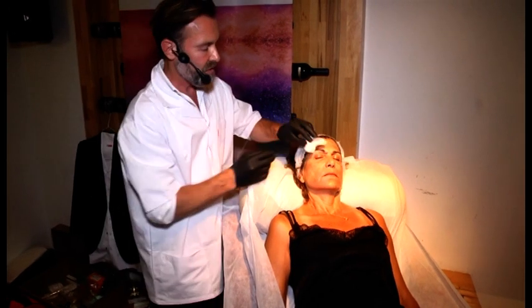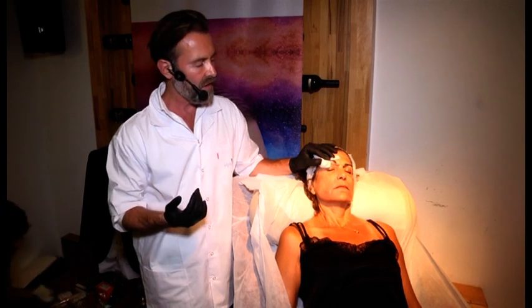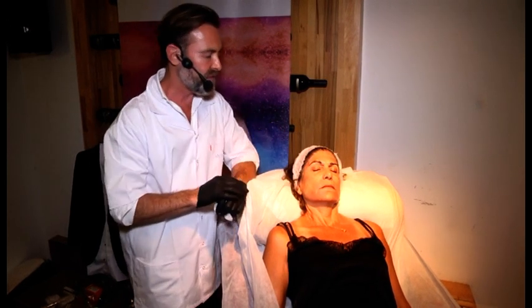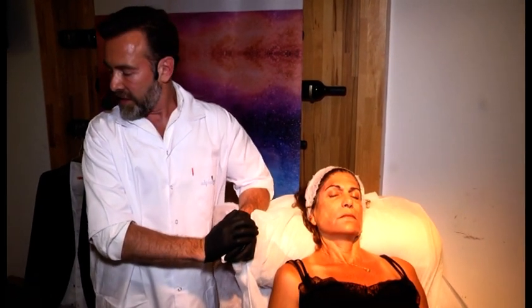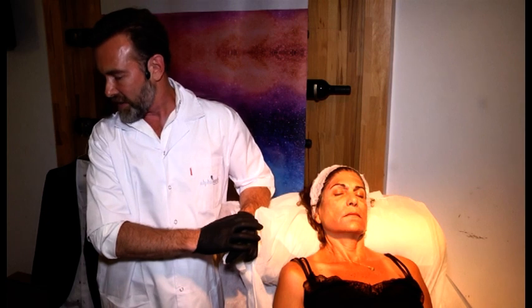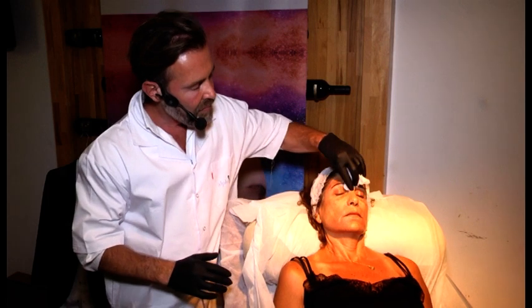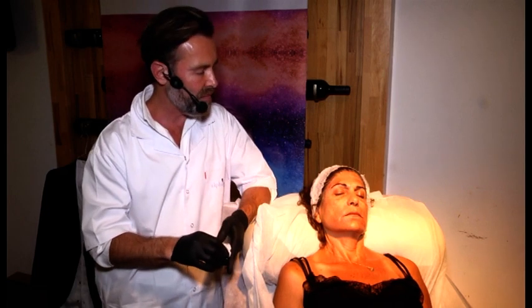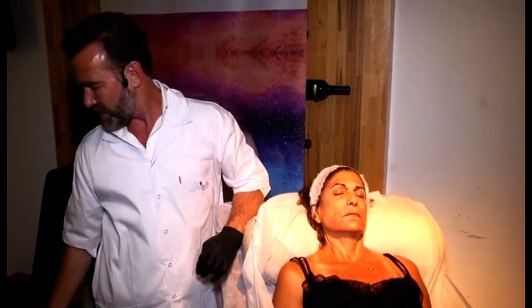And the product of choice in the frontal concavity for me is Belotero Intense. Of course, you can give amazing results with Belotero Balance as well. It's very easy to even out the product with Balance. But yeah, I will use a cannula. I will use a 22 gauge cannula, please. But with Belotero Intense, you need much less product to get the same result. That's why I use Intense, because you need less product to achieve the same result that you can achieve with Balance.